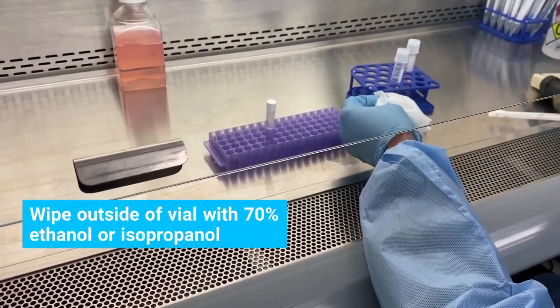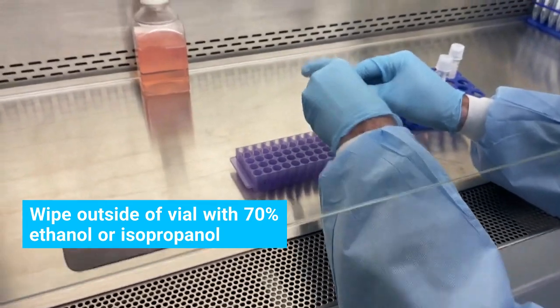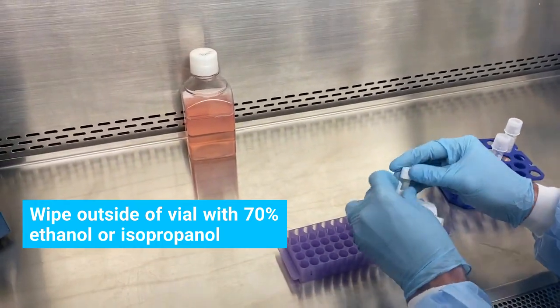Transfer vial to a biosafety cabinet and wipe the outside with 70% ethanol or isopropanol, focusing on the cap area.